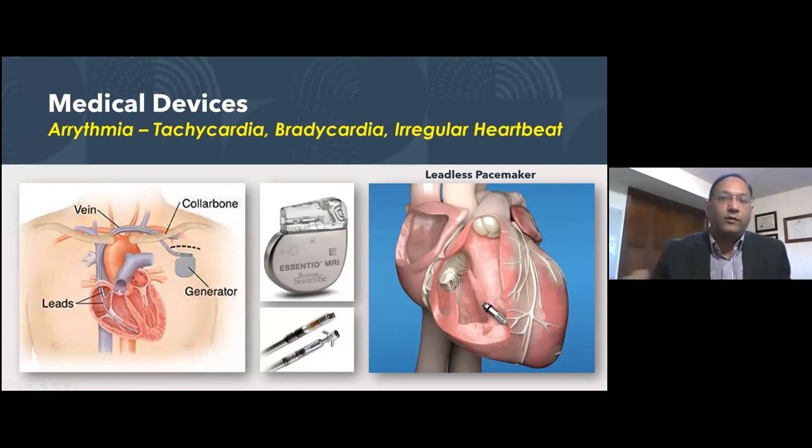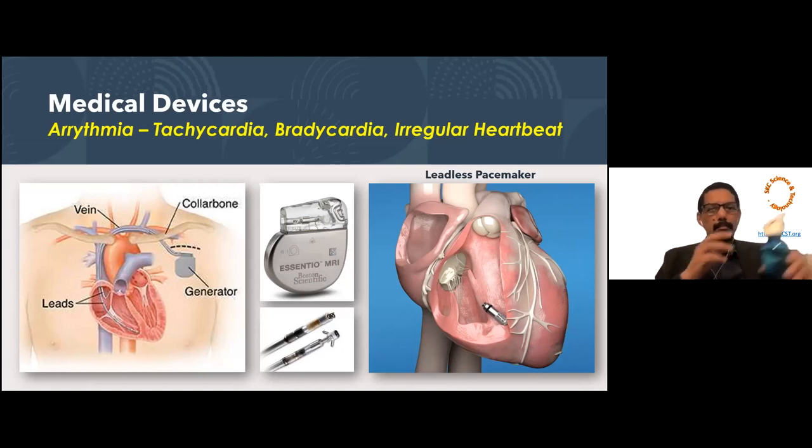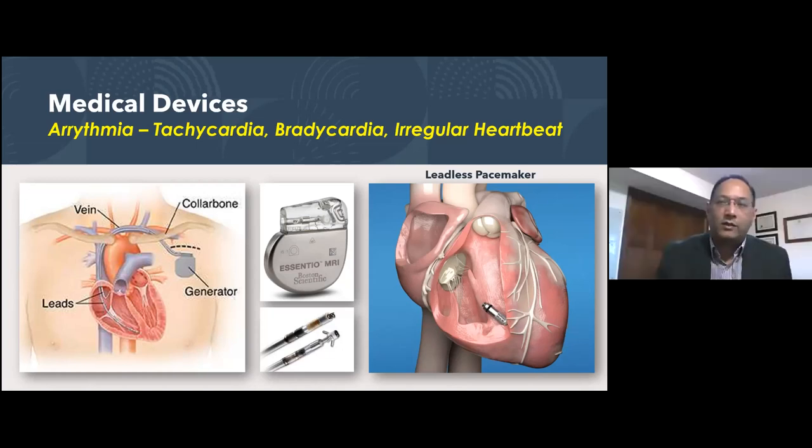One definite issue with this is the battery. Putting a lot of battery in a small package is an issue. So a lot of innovation is going on in this space so that you can retrieve it and put in a new one, because the longevity is not that long today. But that's where the industry is going on the pacemaker side of things, so that the leads and the complications of leads go away.